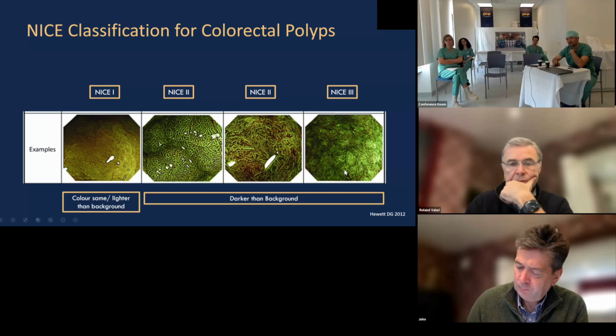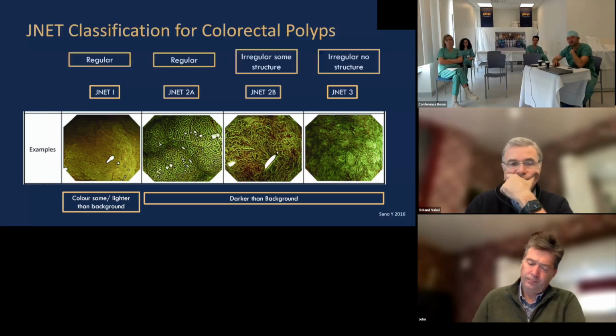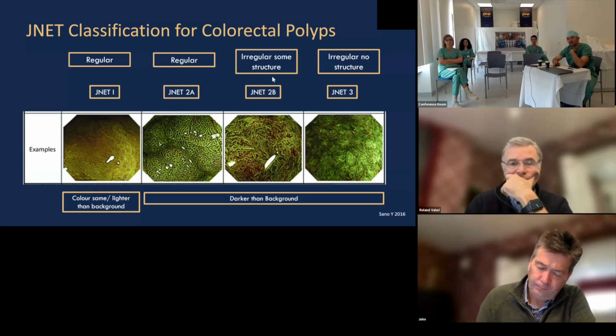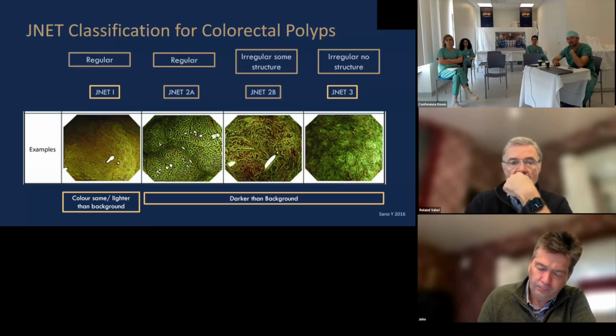And the name is annoying, right? But the more useful classification is JNET. So JNET, this Japanese version of NICE, is what you can maybe think of it as. And JNET splits what we used to call NICE 2. That's these two. So if you just go back, that was NICE 2. And now it's JNET 2, but it splits it into A and B. And the reason why it's useful to split it into A and B is because that's what's useful in cancer prediction.